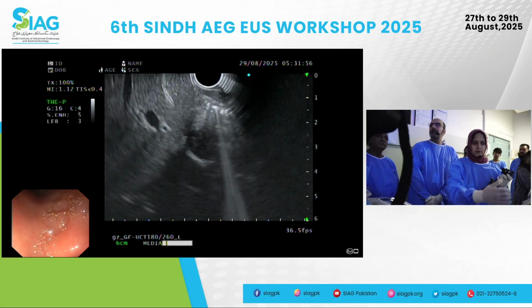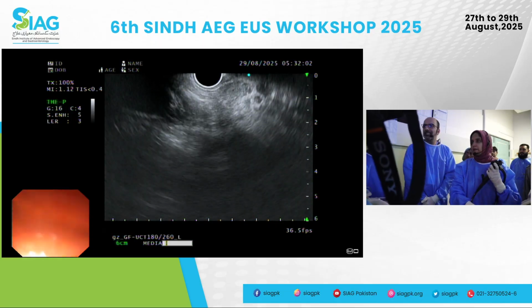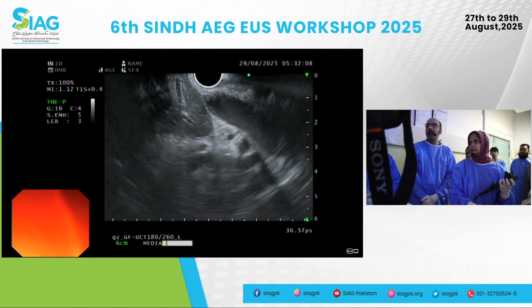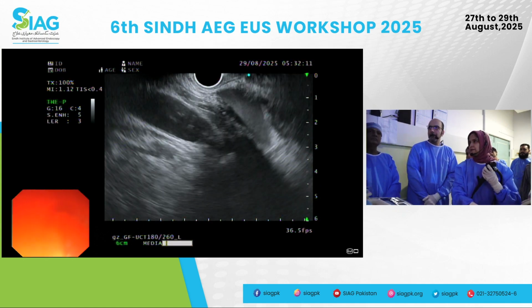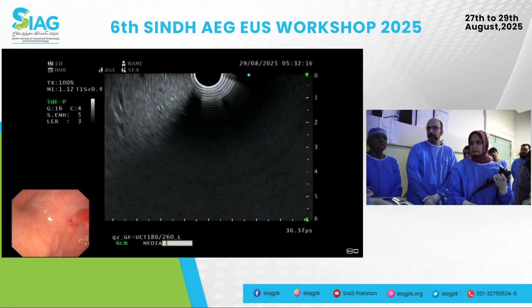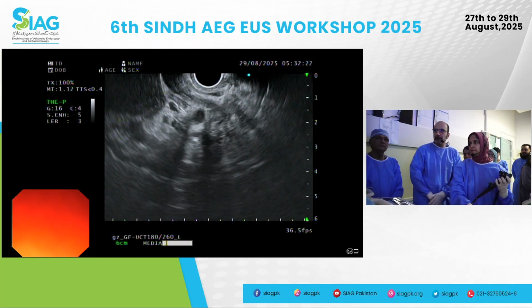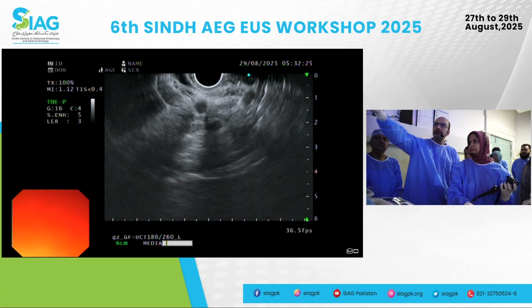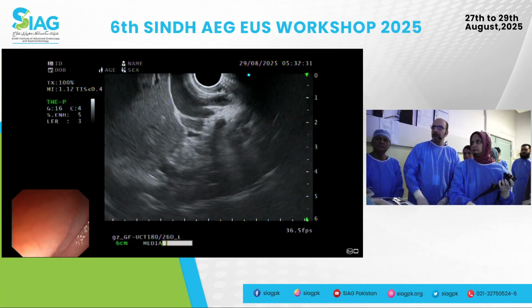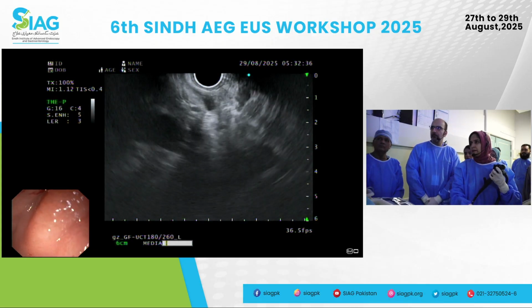So one of the questions here would be whether or not to biopsy. Yes, the purpose of this particular case was that we are seeing more and more patients being treated as autoimmune pancreatitis with no EUS examination, with just an elevated IgG4, and also in the clinical setting of chronic pancreatitis. So if a patient comes with chronic pancreatitis, has a high IgG4, is just diagnosed as AIP, and then they've started treatment as well, we wanted to bring this case and show you that that's not always true.